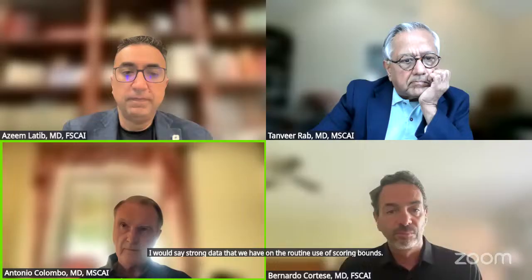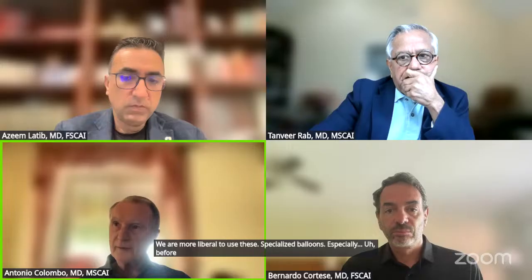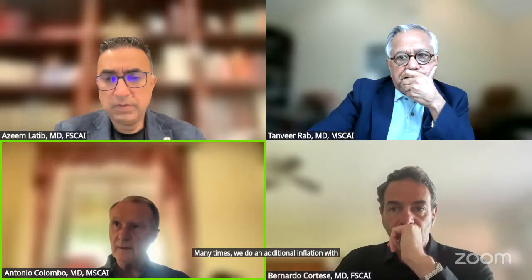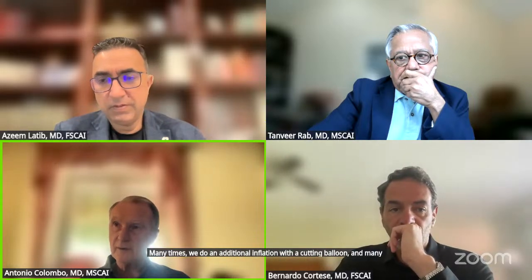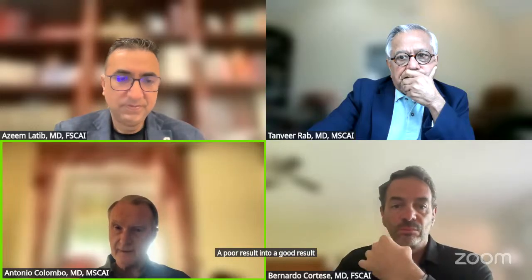We are more liberal in using these specialized balloons, especially before going to stenting. Many times we do an additional inflation with a cutting balloon, and many times we convert a poor result into a good result and avoid stenting.